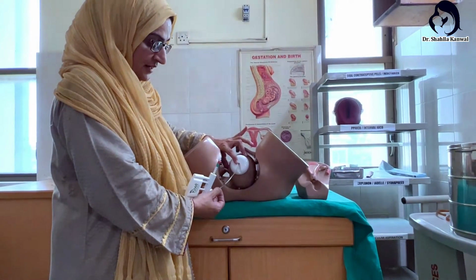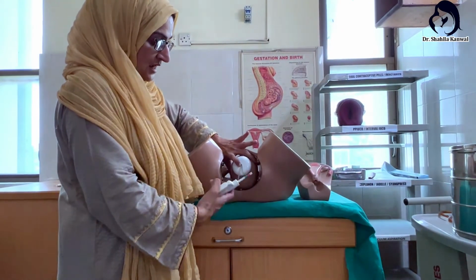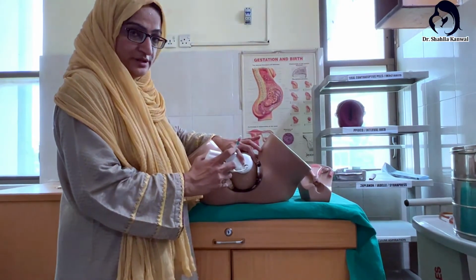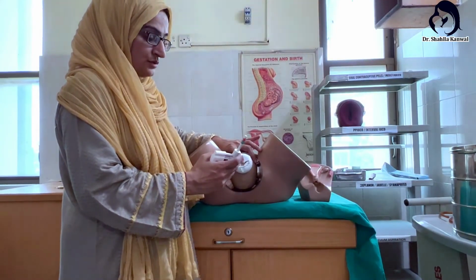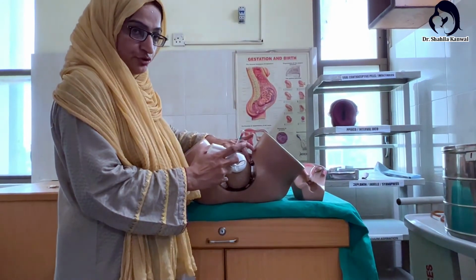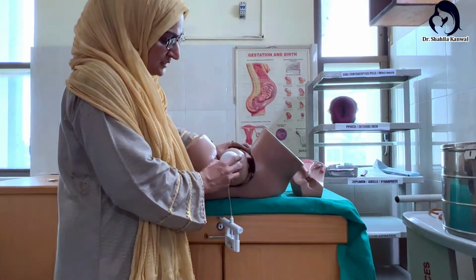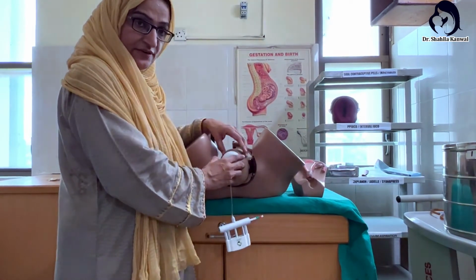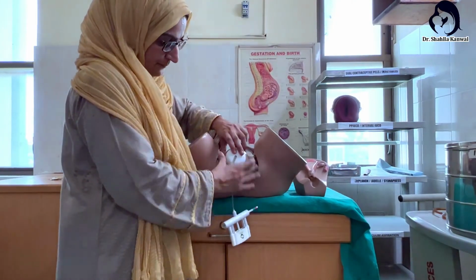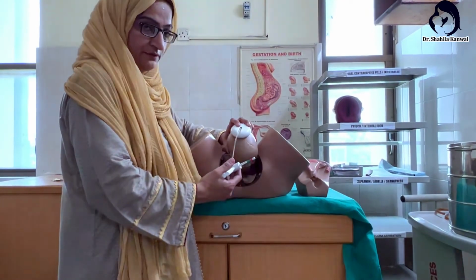There are two markings, 11 cm and 6 cm, over the insertion tube, and you can easily measure the distance. After that, you have to create the pressure. When you create the pressure, the whole of the bar should go inside. With the pressure, only the red portion should be visible. When you apply this pressure, the baby's head will be delivered with the maternal uterine contraction as well as with the maternal pushing effort. This should be the delivery of the fetal head.